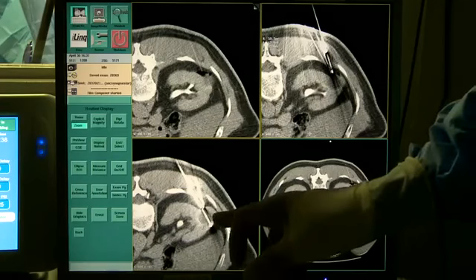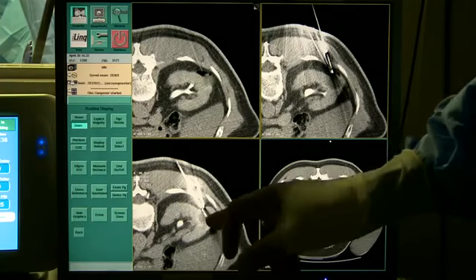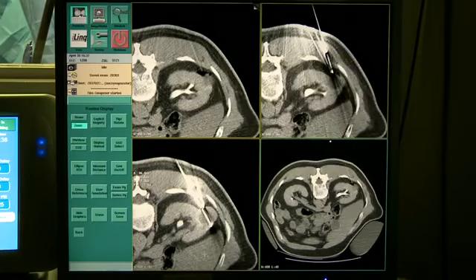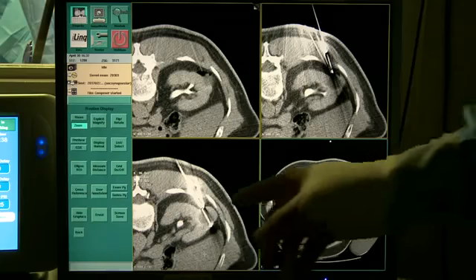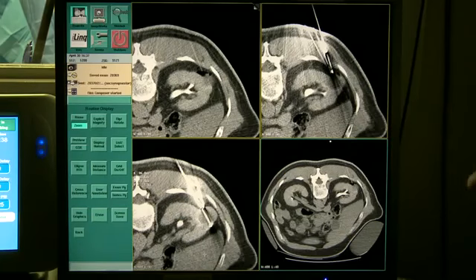When you look at where you want your probes, this probe will treat the medial aspect of the lesion. And then you want to ask yourself what's above and below it. Again, on this next lowest cut and this next lowest cut, it looks like we're running out of tumor. So this will be a little lower. So certainly we're going to take care of the lower part of this tumor. This should take care of the inside of the tumor. This should take care of the outside of the tumor. So we've got 2/3 of the tumor covered with these two probes, I believe.